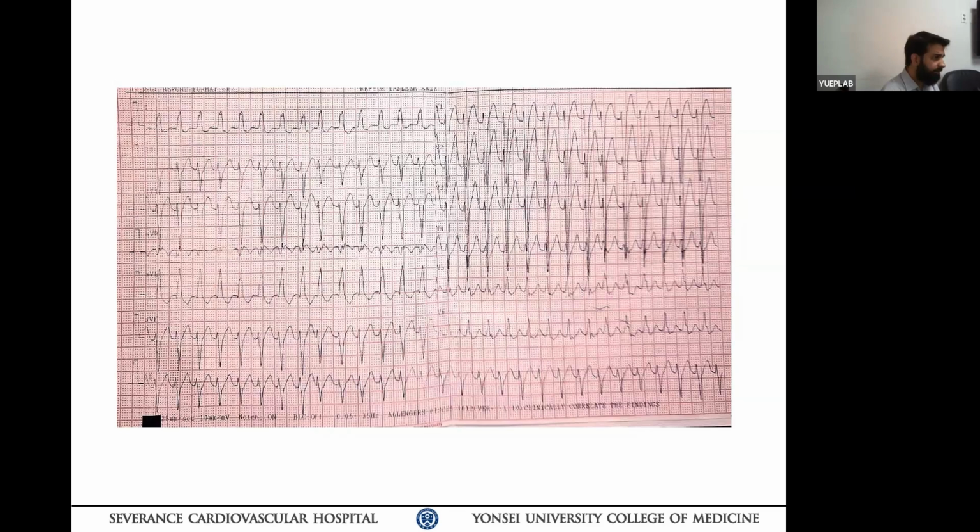Okay, I think that experienced doctors favor SVT, but the fellows favor VT. Maybe the coffee led to some bias, or it's right.